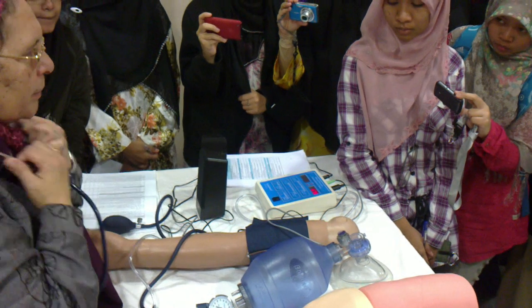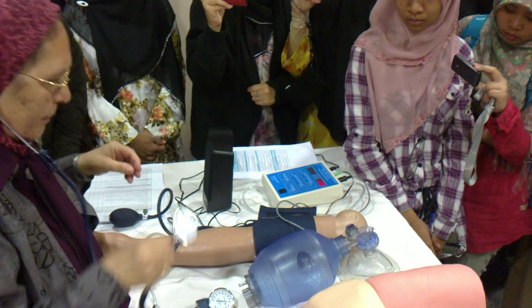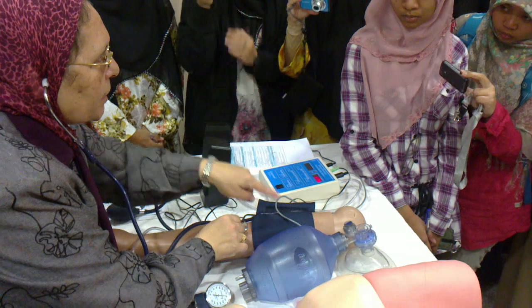And then I put the stethoscope in my ear and I place it on the antecubital fossa, not under the cuff.